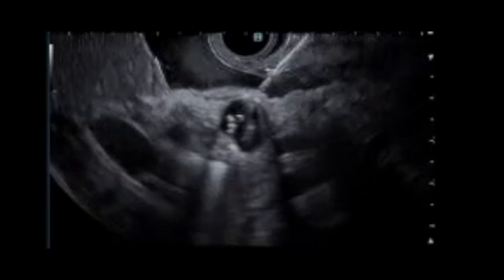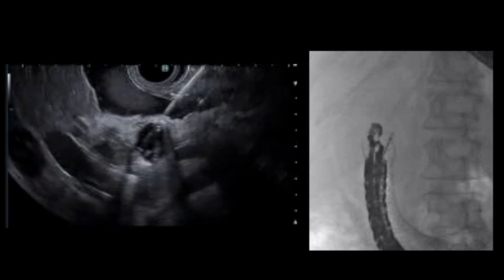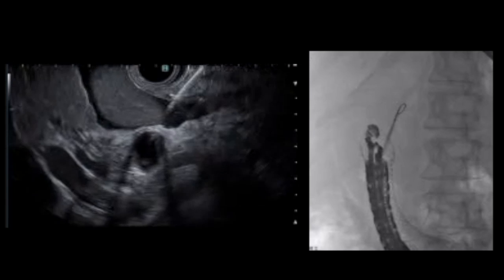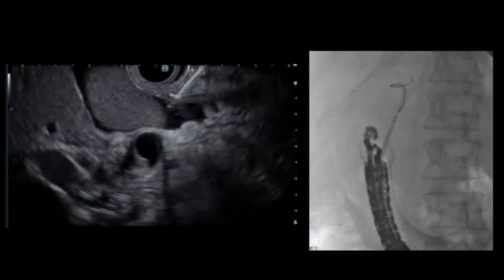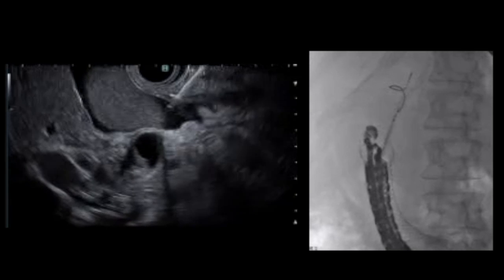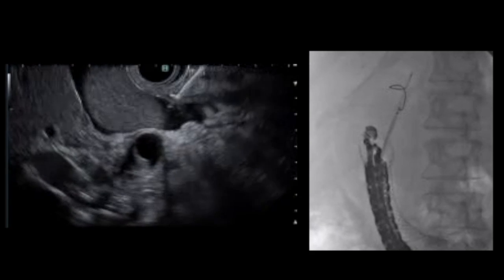in order to reduce the occurrence of the bile leak and possible infection of the ascites. The tip was then advanced into the dilated bile duct, and an angled 0.025-inch wire was advanced towards the proximal bile duct immediately. The LAMS device was further advanced into the bile duct over the wire.